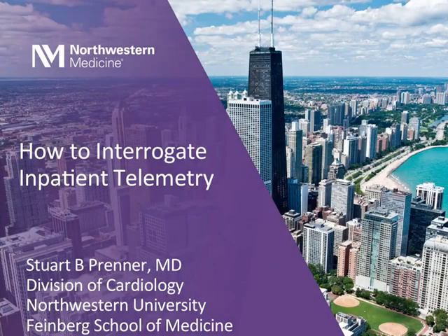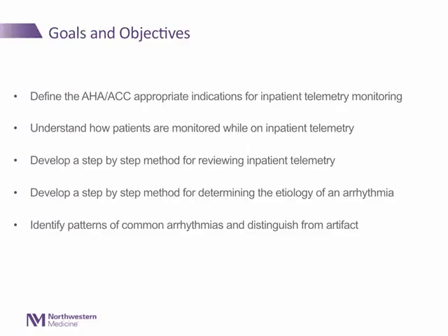The following educational video was developed to help the viewer identify and interpret clinically significant telemetry events that occur while patients are being monitored on inpatient telemetry. By the end of this video, the viewer should be able to define the current guidelines for appropriate and inappropriate use of inpatient telemetry monitoring and to understand some logistics related to ordering and placement of patients on telemetry monitors.